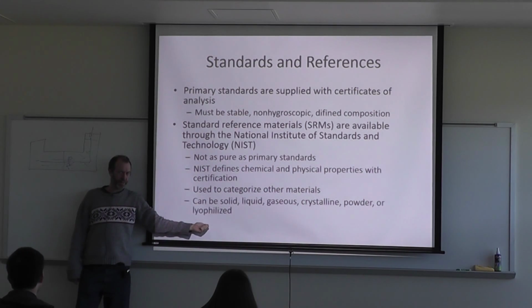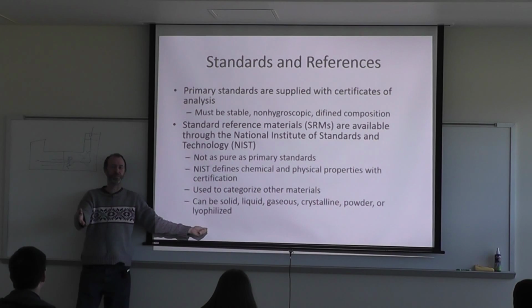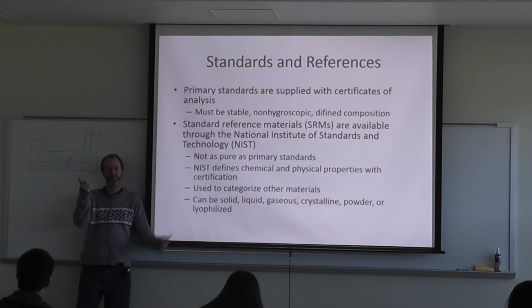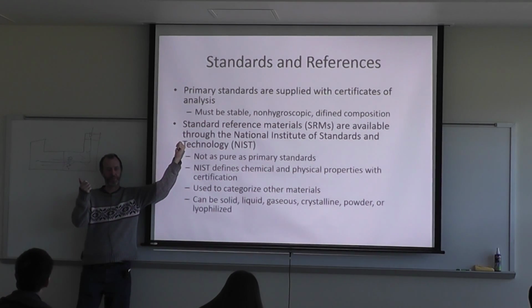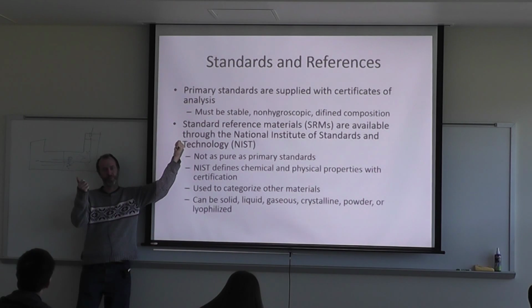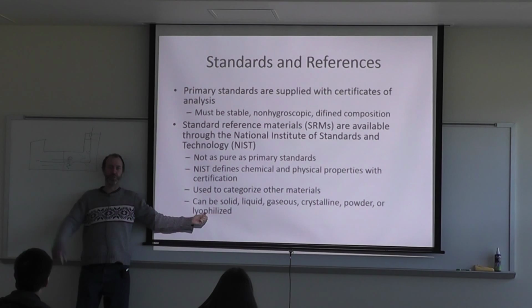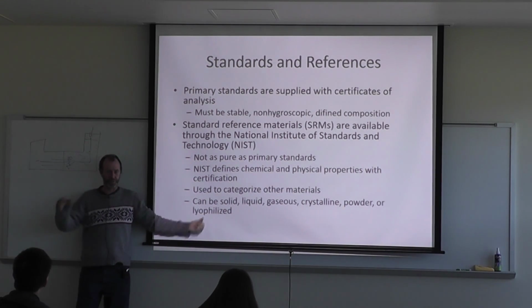Do you guys know what lyophilized means? No? Dry, frozen. Yes, freeze-dried is lyophilized. So your lyophilized standard is going to tell you to add a certain volume, probably of reagent water or CLRW water, and it'll be at a known concentration once you add that water and resuspend it in solution.